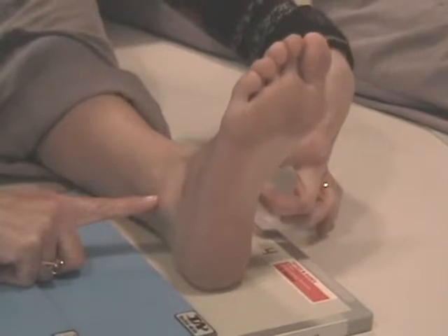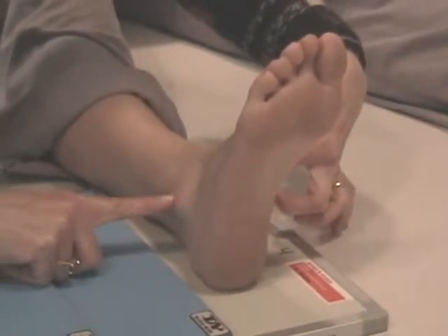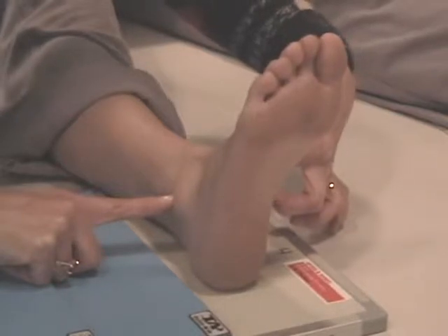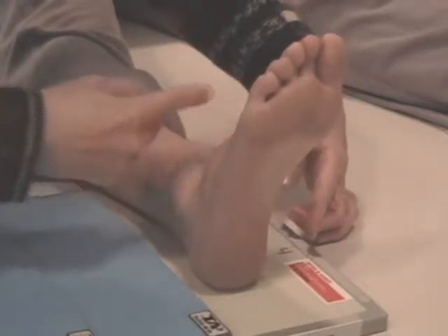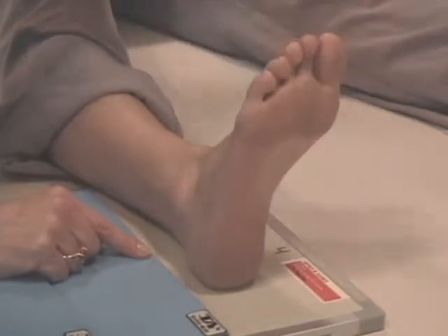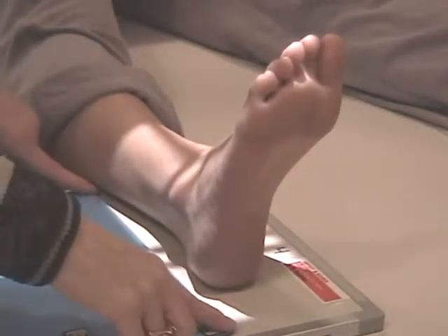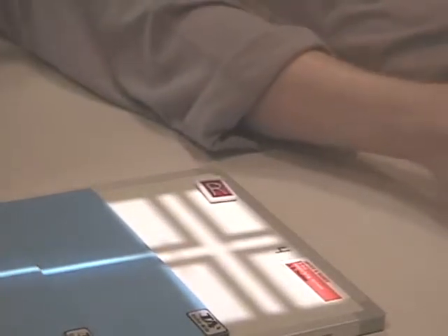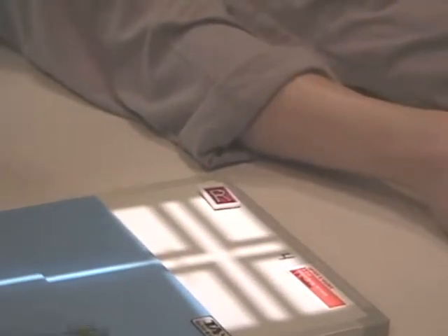Okay? I've divided the cassette into thirds. I've positioned the patient so the intermalleolar line is parallel, most patients being a 15 degree medial oblique. The ankle joint is to the center of the film. CR is to the center of the film. Equal light, baby light, and an R marker on there. Okay, I can make my exposure and have my patient relax. Notice I have her protected with lead.